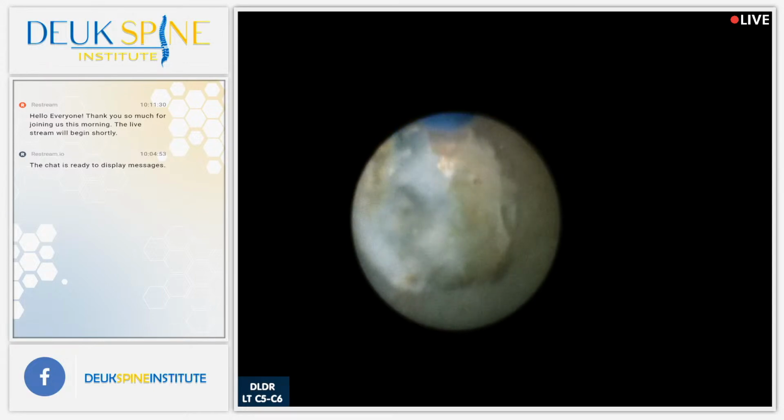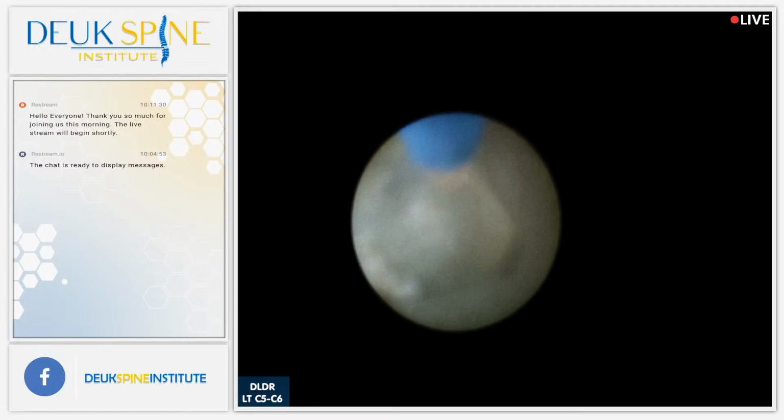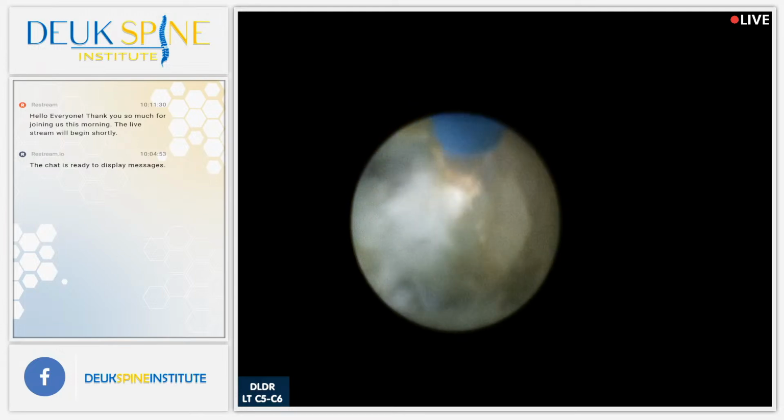And he was asking me about the precision in which I can use this laser. And I told him I can literally peel off tissue 1/10 of a millimeter thick. There is no other tool in medicine that has that precision. Okay? And of course, it's not just the laser that allows me to do that. You actually have to be able to see what you're doing, which I can see because of the endoscope.